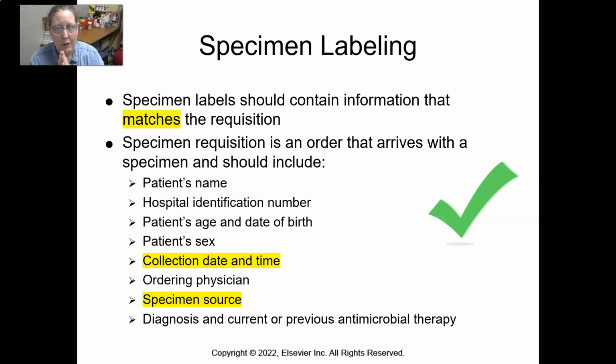Again, there are a lot of swabs. Once you get a swab, it could come from anywhere in the body, right? So it's really important to note that. And even if it's a wound swab, a patient could have several wounds. We need to know where it's from and which wound it's coming from.